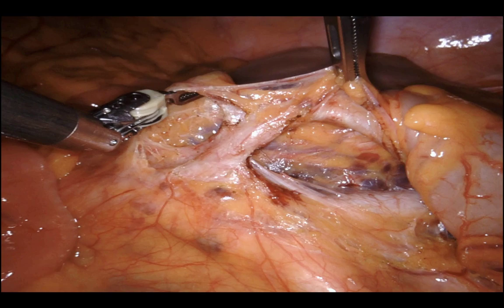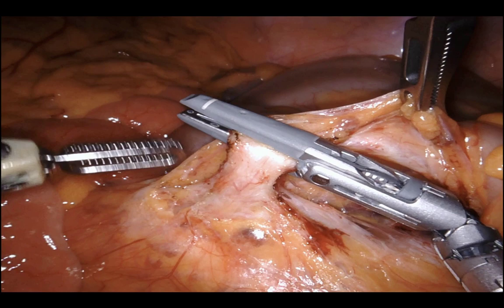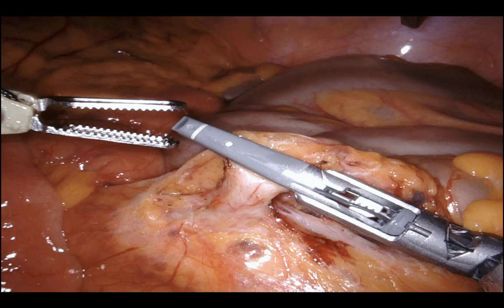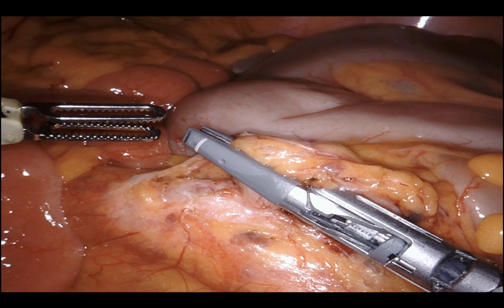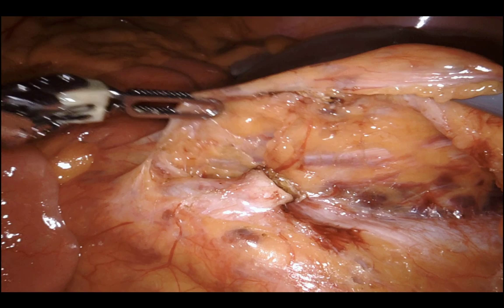I made extremely light edits so instrument exchanges aren't so painful — no magical robot here. I'm a little obsessive with vessel division: I seal about four times, check the seal, then cut. Once the pedicle is divided I hand it to my third arm and lift it directly anterior to the anterior abdominal wall.